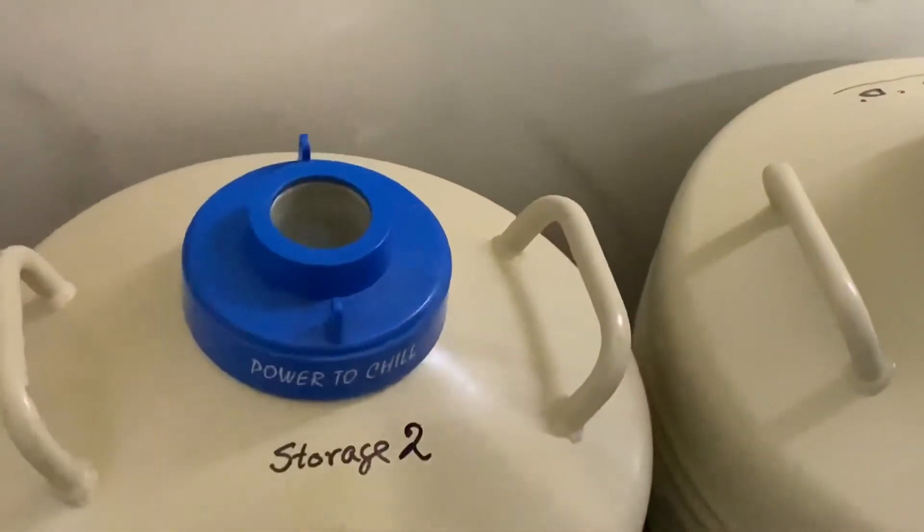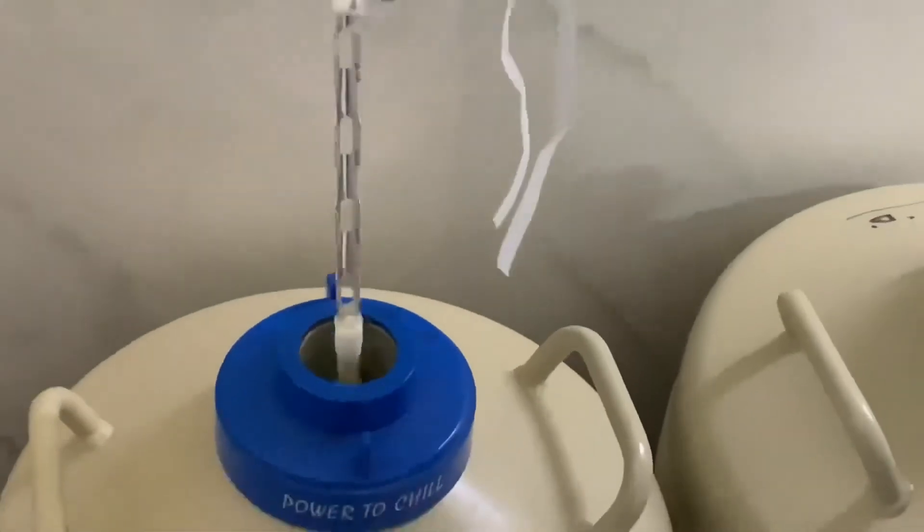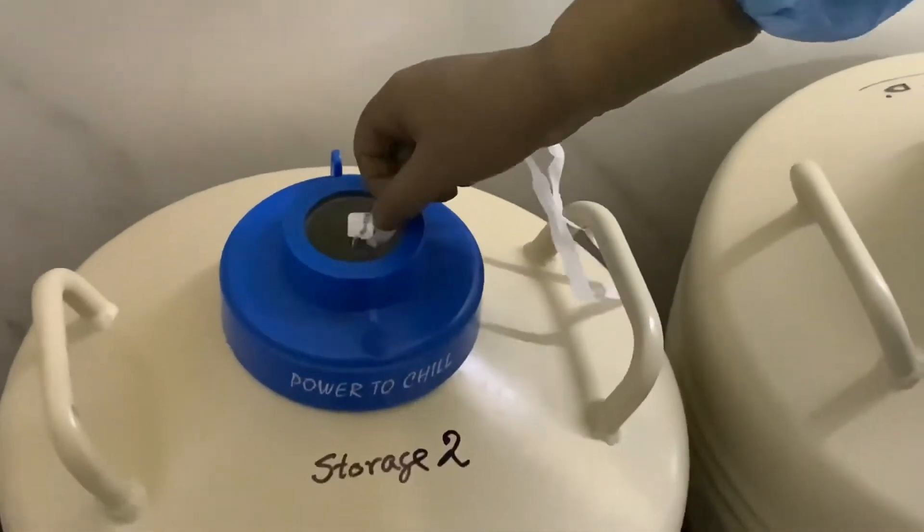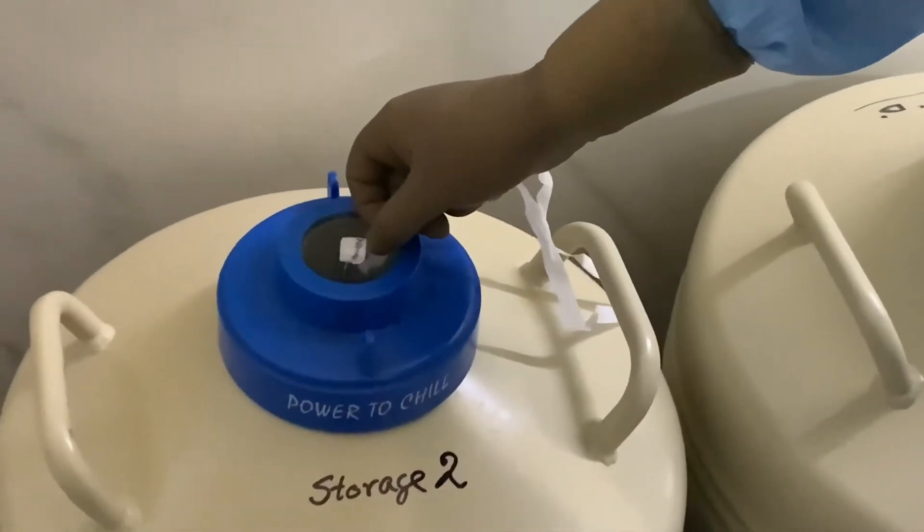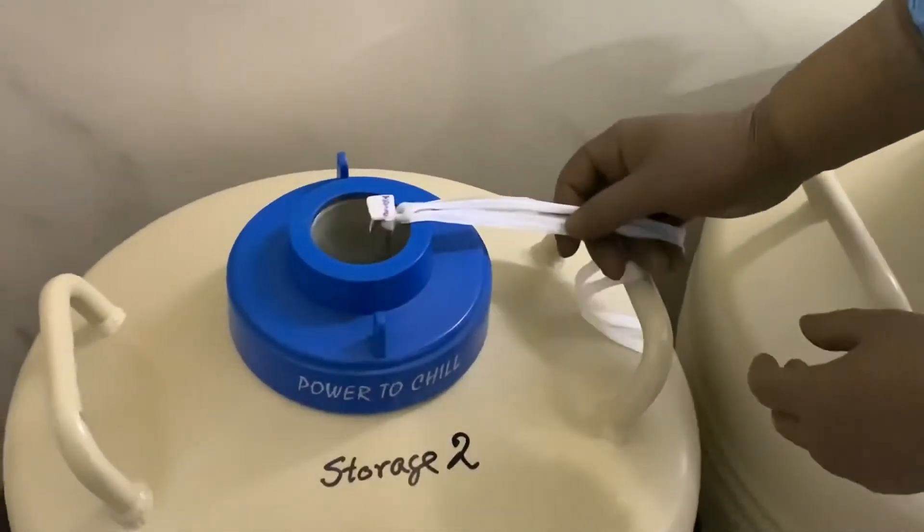Now we are going to the liquid nitrogen can. So here inside this liquid nitrogen is there. We will be plunging this particular one inside the liquid nitrogen vapor for at least half an hour. We will be keeping it like this.